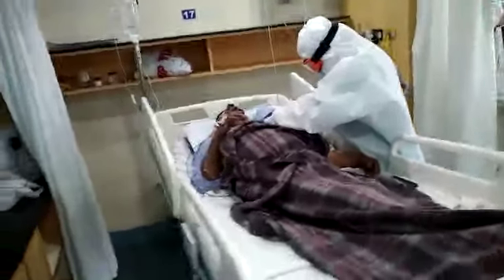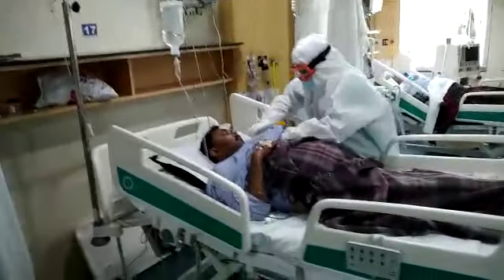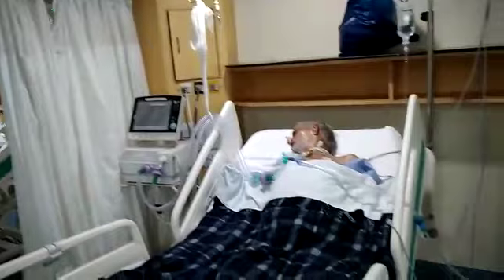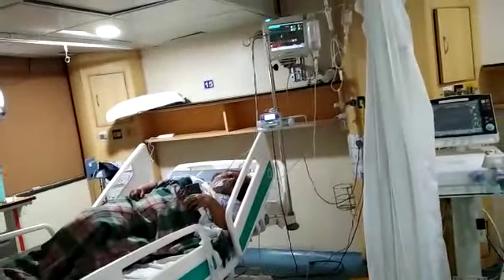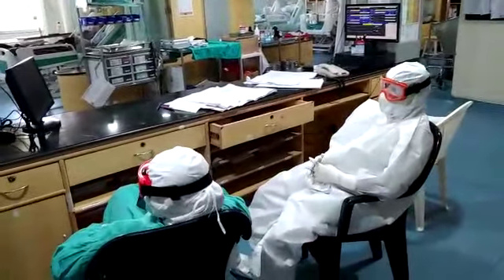ये हमारे स्टाफ हैं जो कि टेकिंग केयर ऑफ द पेशेंट इन PPE. दिस पेशेंट ऑल्सो केम विद द शॉर्टनेस ऑफ ब्रेथ, डिस्निया एंड हाई ग्रेड फीवर, सोर थ्रोट. हमने यहाँ से इसको बंद कर रखा है. दिस इज अनदर पेशेंट ऑन वेंटिलेशन सपोर्ट. One more patient who is due to hypotension on inotropic drug. And these are our corona warriors.